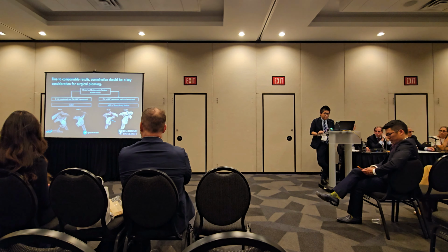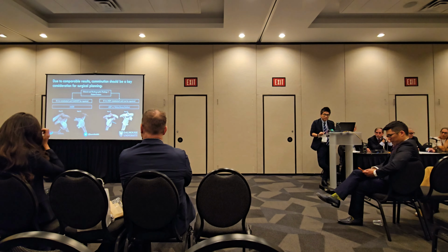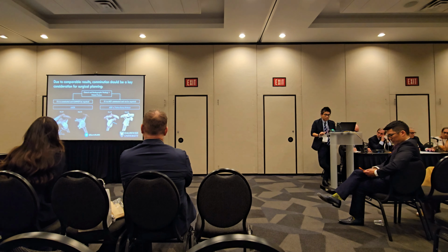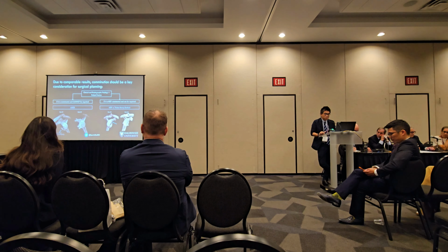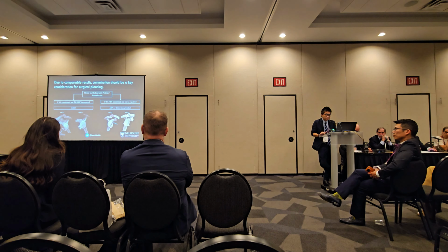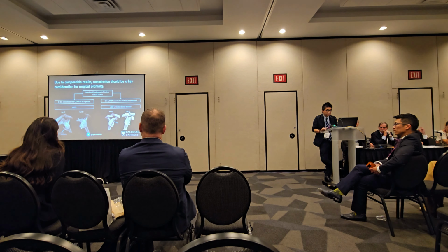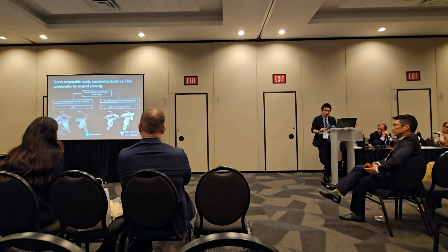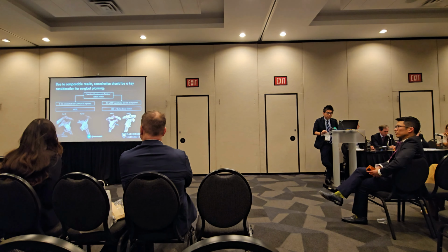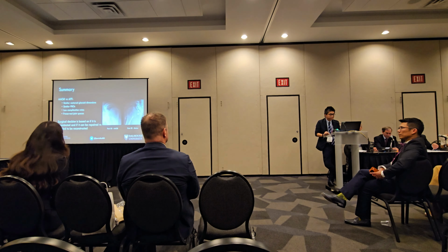In consideration that clinical outcomes are quite the same between fracture fixation and glenoid reconstruction using distal tibia allograft, when the fracture fragment is comminuted, arthroscopic anatomical glenoid reconstruction using distal tibia allograft should be selected. And when the fracture fragment is one big bone block, arthroscopic fracture fixation using EndoButton should be selected.